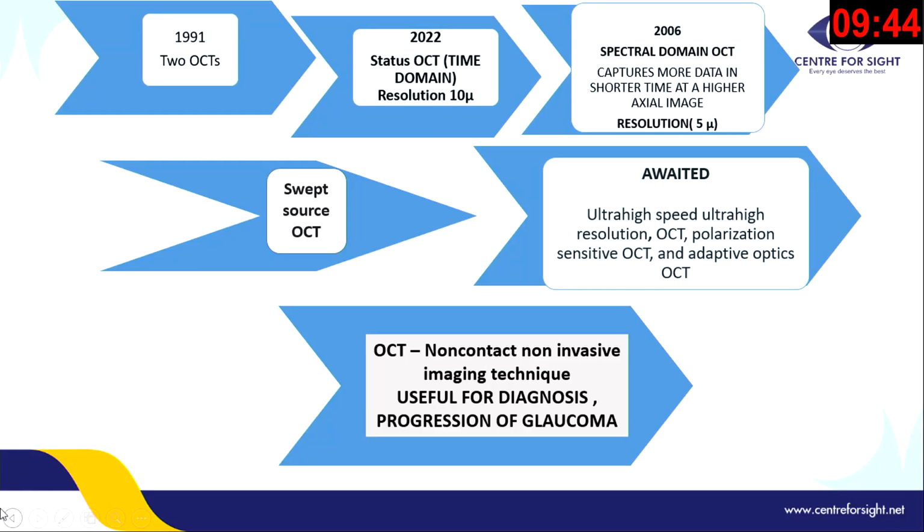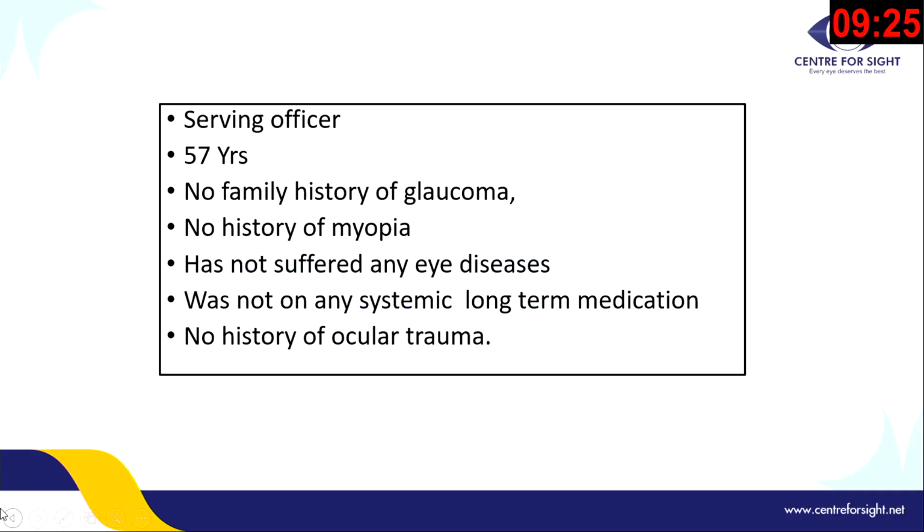So we've come a long way from 1991, where we didn't even see the first two OCTs, and now we have come down to swept source OCTs, and we are awaiting a lot more into our armamentarium. It's a non-contact, non-invasive imaging technique. It's very useful for the diagnosis, prognosis, progression, and many other things which I'm going to talk about.